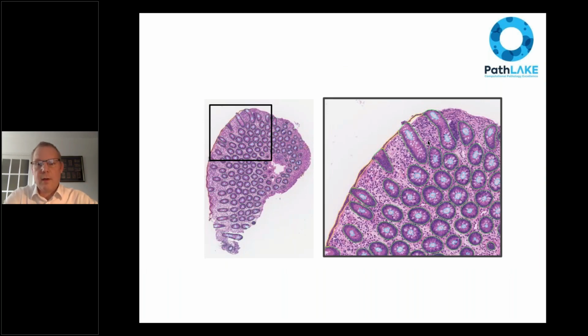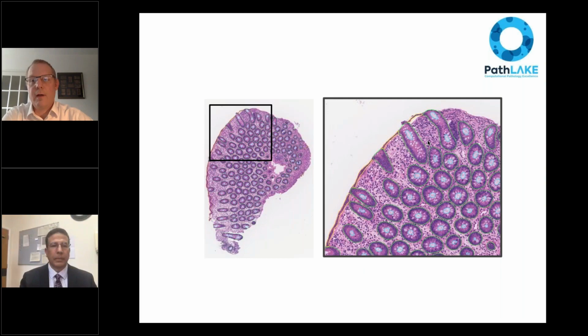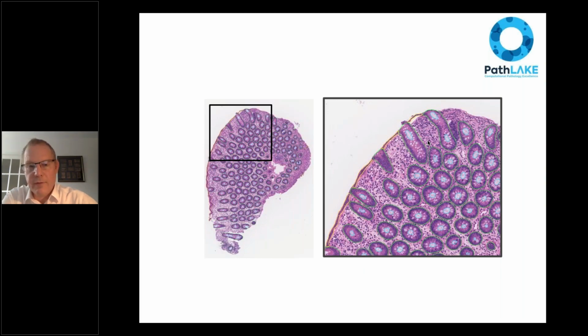But don't despair, because help is at hand. There are means of automating this entire process. So as it's taken us many hours of time to produce that ground truth for the initial set of slides we've annotated, we are now able to automate this large part of this task by means of deep learning, of course.